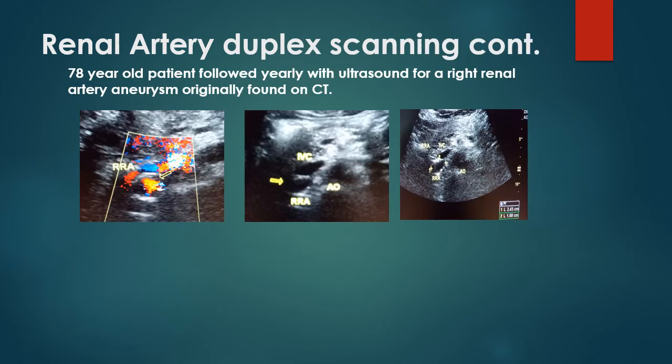Here is a 78-year-old patient followed yearly with ultrasound for a right renal artery aneurysm originally found on CAT scan. You can see the right renal artery aneurysm in this image, measuring approximately 2.45 by 1.68 centimeters. You can also see the aorta and IVC in relation to the renal artery aneurysm.